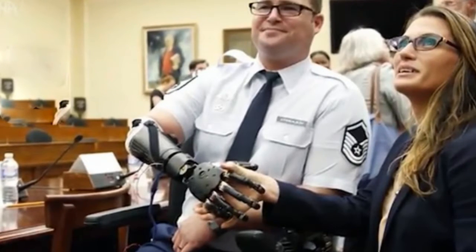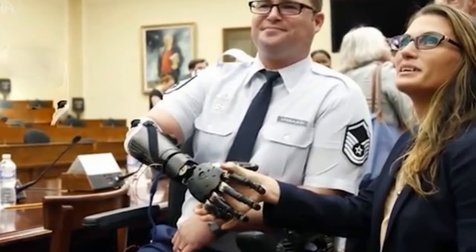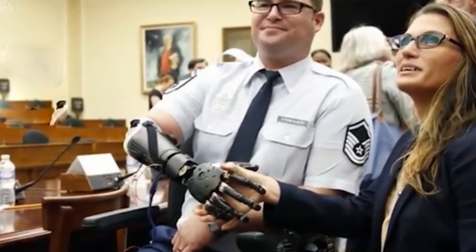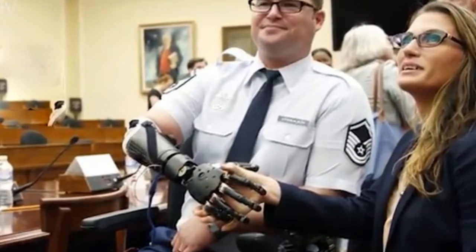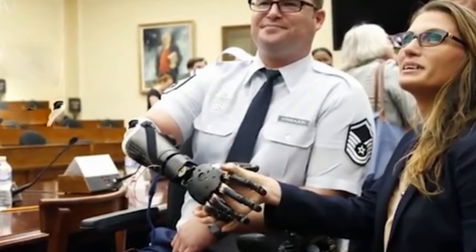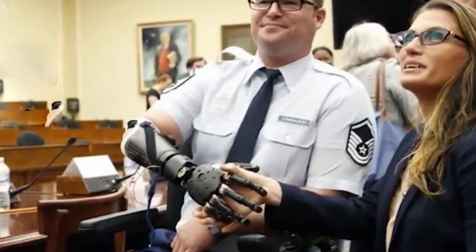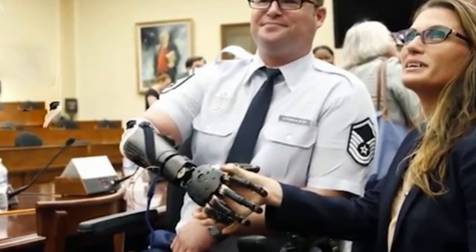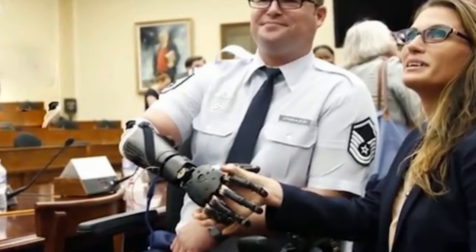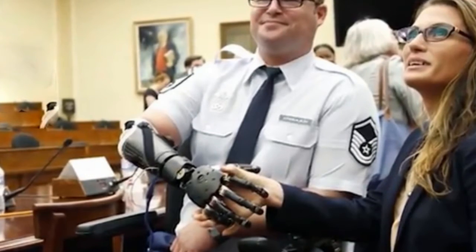He had configured a weighted attachment for the implant that was about 3 pounds, and he had been doing exercises on his own with this weighted implant, which really put us in a position to do more right from the get-go, says Courtney Moran, a clinical prosthetist who works closely with patients. Along with individual finger control, the MPL gave Matheny the ability to move fingers simultaneously and grasp objects, and gave him 2 degrees of control at the wrist.